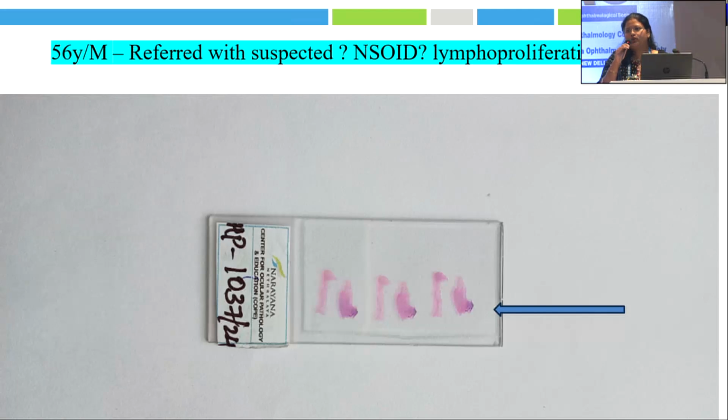As a pathologist, you can see the slide, I'll just show the external part of the slide, not what I see in the microscope. We're seeing some stained tissue there, and it's a little pink, not blue. As soon as I reach my table daily in the morning, I just see my trays grossly. Whenever it's a lot blue, I pick those slides first, because I know I'm looking at a malignancy, because there the nucleus is more and it tends to be more blue. But here it was a little pink.